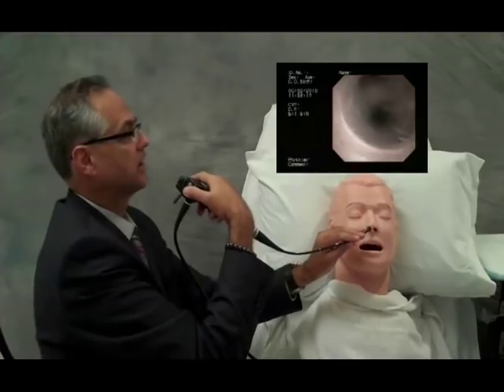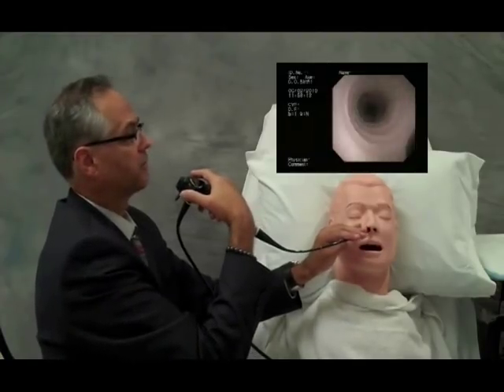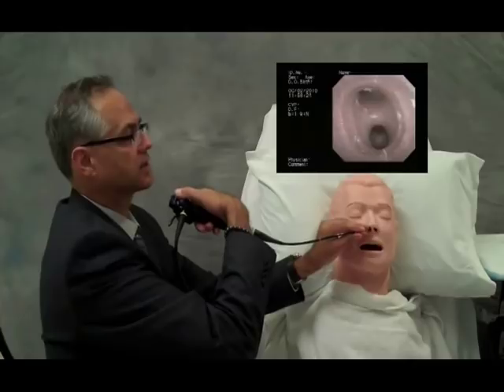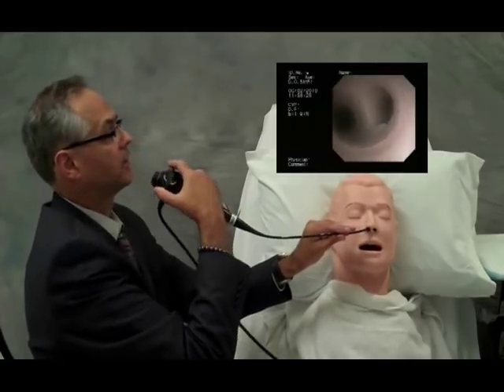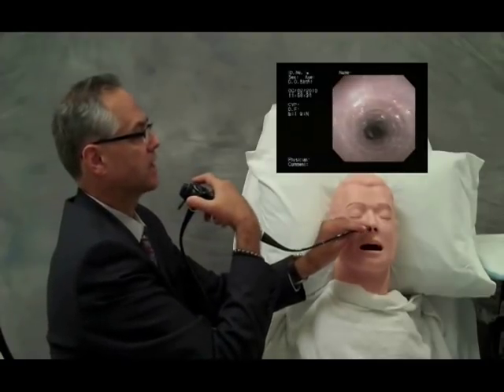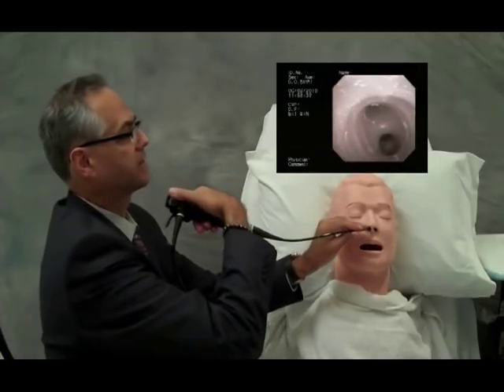We rotate the wrist and move the bronchoscope down to the takeoff of the right upper lobe. Coming back to the carina, we now navigate the scope down the left main bronchus, again to the takeoff of the left upper lobe. Once more, rotating at the wrist — right side, left side.